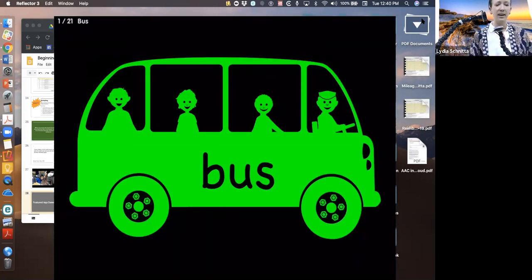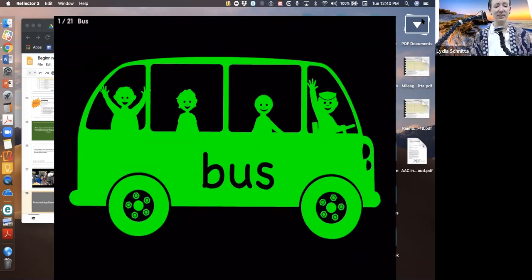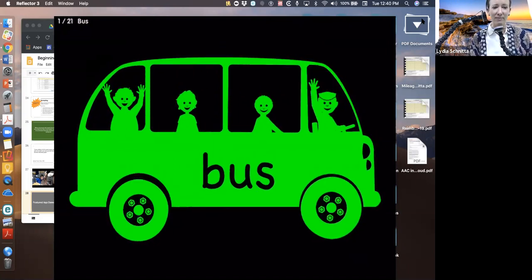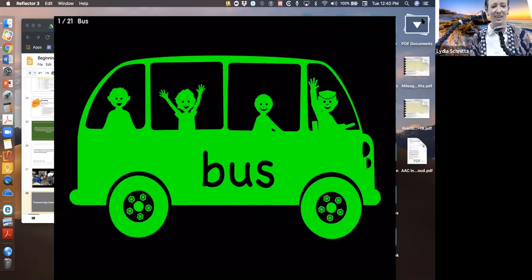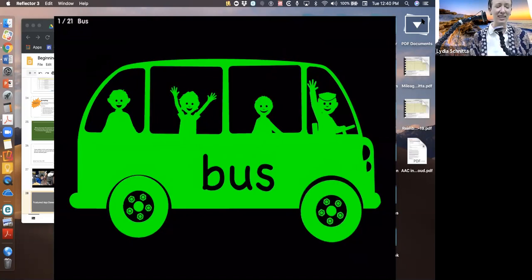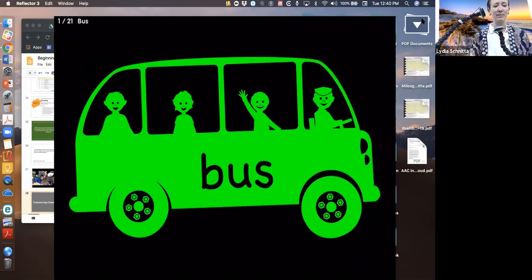Okay, and one gets attention from maybe the kids in the room, and the other one, this button will not do anything until the animation's finished, and there's a little bit of a delay.